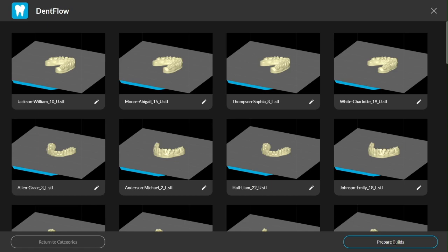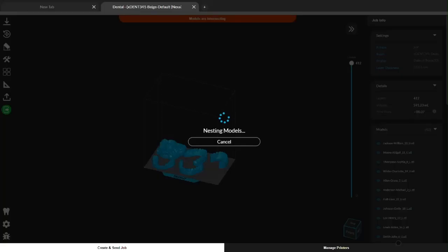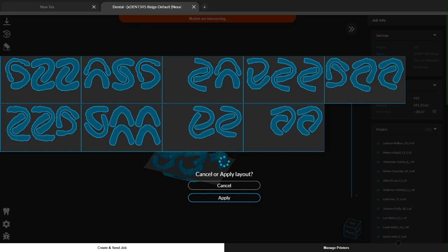The software will take a few minutes to optimally nest the models as tightly as possible. Any overflow will be batched into separate builds. When it's finished, I will get a preview of the nesting results. In this particular case, I was able to fit those 48 models across 9 builds.